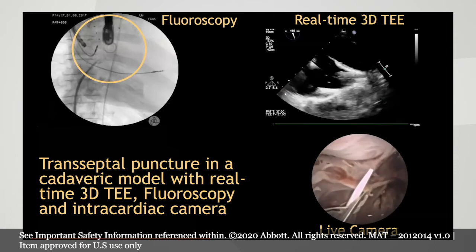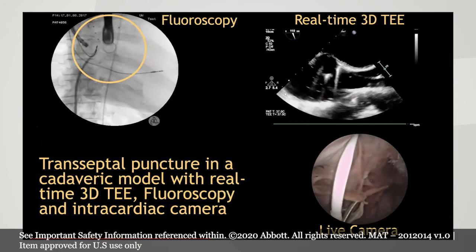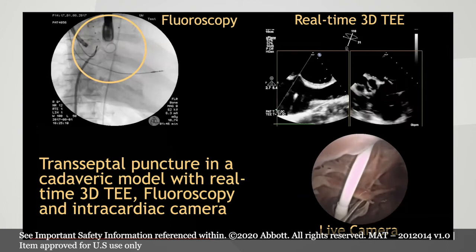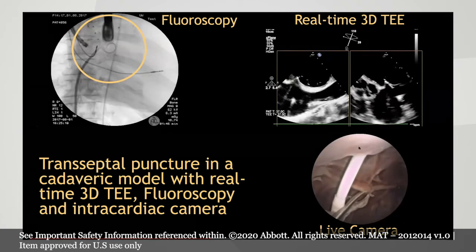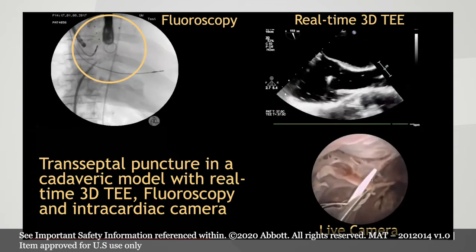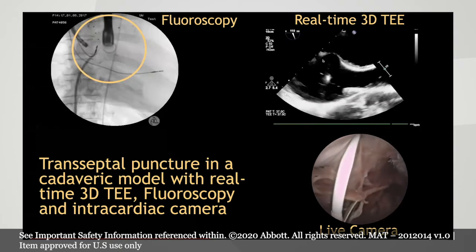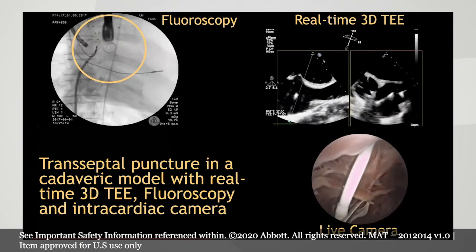So when you look at these images in concert, it helps to really conceptualize the fact that yes, we're going with a needle that comes from the IVC, as you see in the right lower example, and goes against the septum in sometimes a pretty tangential angle. But in this example, you see that we're actually achieving a pretty good attack angle, if you will, towards the septum, and then the tent will form quite nicely here in a bicaval view.